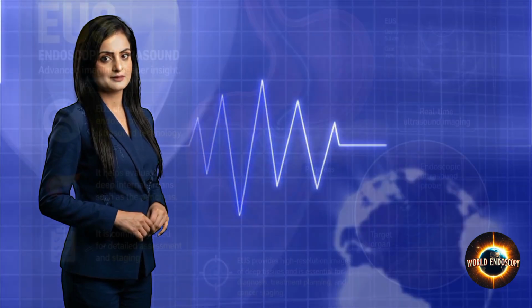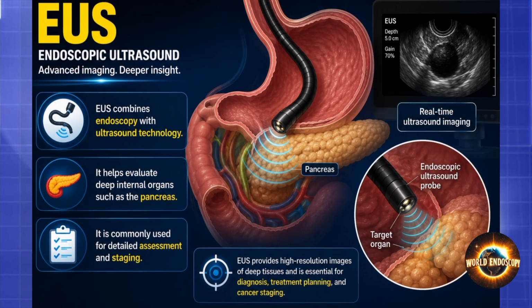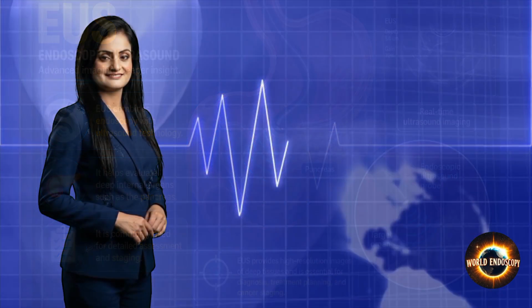EUS combines endoscopy with ultrasound technology. It helps evaluate deep internal organs, such as the pancreas. It is commonly used for detailed assessment and staging.